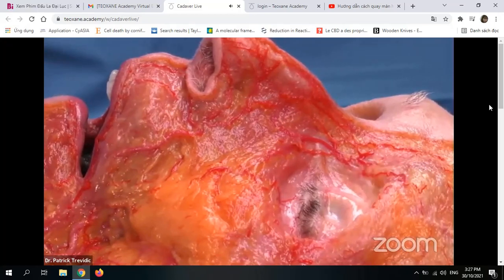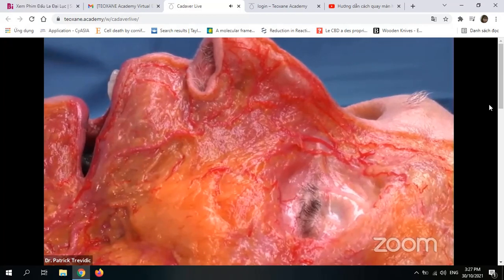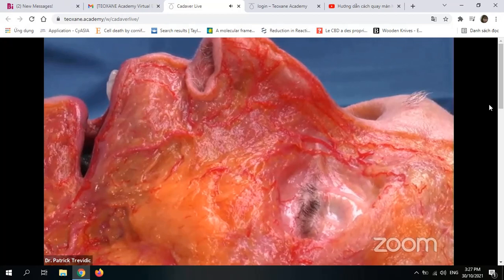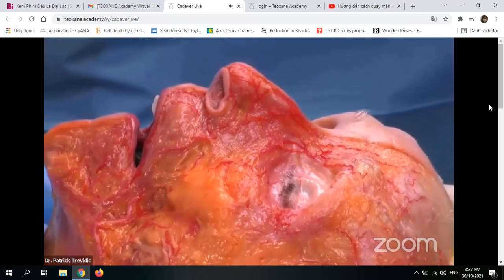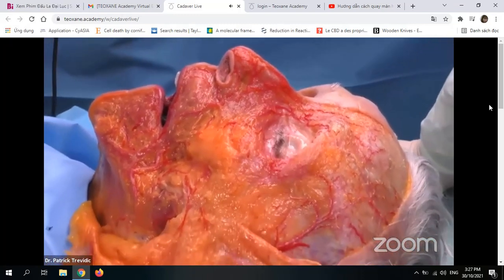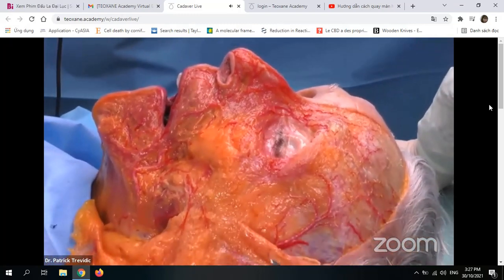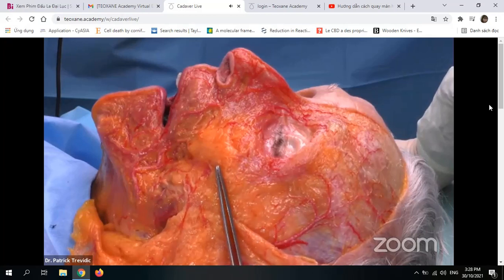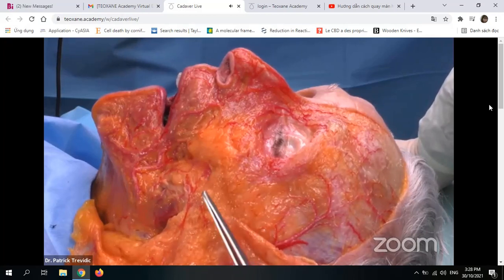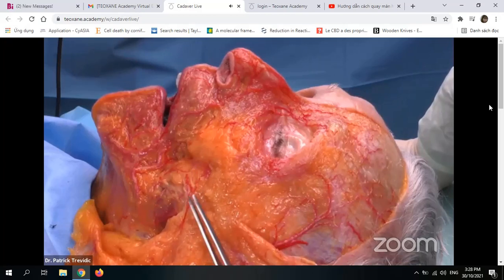If we go to the fat and we dezoom a little bit, you can see here, if we dezoom this plane and we get the full plane, you can see another artery very well, that is here, your transverse facial artery. So this artery is below the zygoma. The zygoma is here, and you see that these branches are very, very superficial here and above.